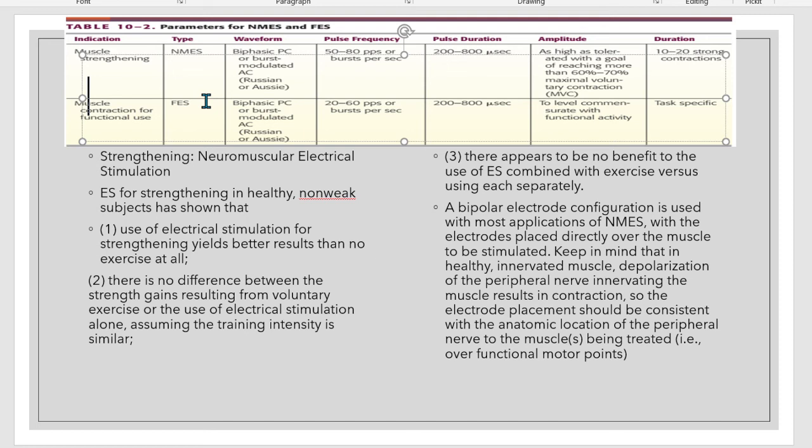So inana siya pag counting, so sa face, sa mga Bell's palsy, mao na siya, no? So you go with the different branches of the nerve, starting from your temporal, then your orbital, frontal, then your zygomatic branch nga nasaplayan sa facial nerve, maxillary, then sa imong mandibular nga branch. So i-count na siya tag 10, 10, then balik ka sa taas, then down another 10 hantod makaabot ka og 60. So 6, no?